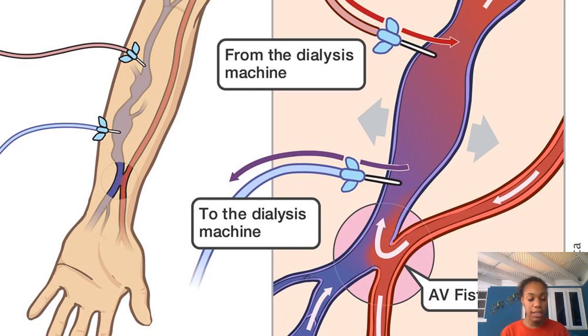So it is not at all uncommon to see dialysis patients with numerous or more than one AV graft, because sometimes one access may get old or the access might not be working properly, so therefore a new access must be made for the patient to have dialysis. So sometimes when you go to dialysis, the nurse might ask the patient which one is the newest AV graft or which one is working. Then the nurse must also check to see the presence of any bruit or thrill.